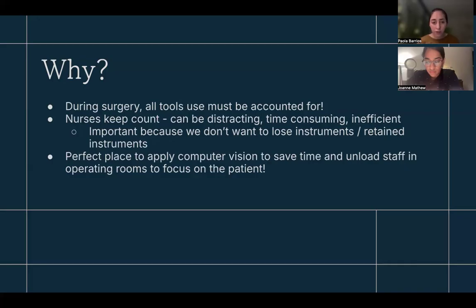This can be distracting for them if they have to focus on a different task that's not really related to the operation. It's time consuming. Every time they count, they count all of the instruments. It's also quite inefficient because it's a manual count that requires two people double checking each other, counting multiple times for accuracy. And again, it's important because we don't want to lose these instruments.